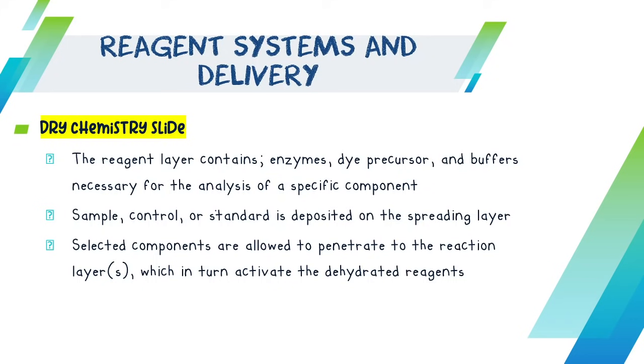So, that's why the dry chemistry slide is nice, right? No need for you to mix reagent manually. Very simple and less time consuming and less labor use.